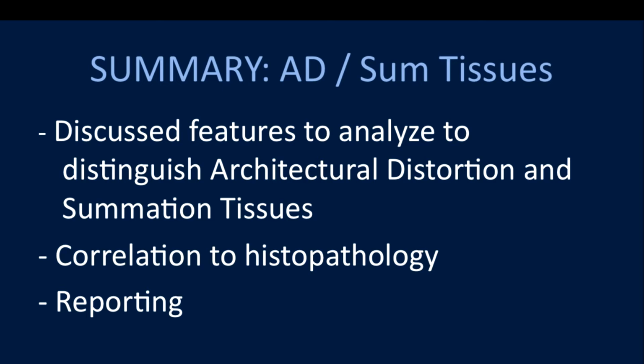But you could also say, she's very dense, she's got a lot of stuff going on, I want to make certain that this area of summation tissue stays looking this way. Let's say it's an invasive lobular cancer, and in spite of all the data you're presented with, that there are no straight lines in a spoke wheel pattern, you really want to make certain that this is the way it's going to stay.